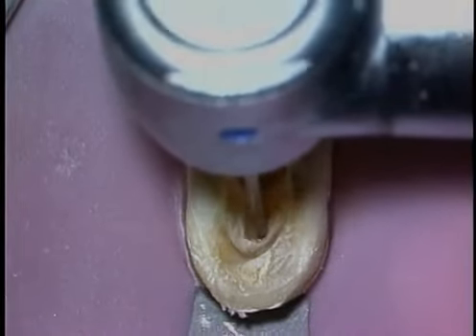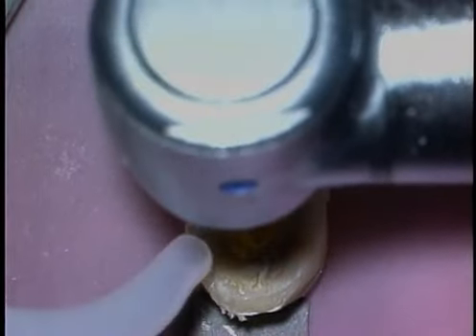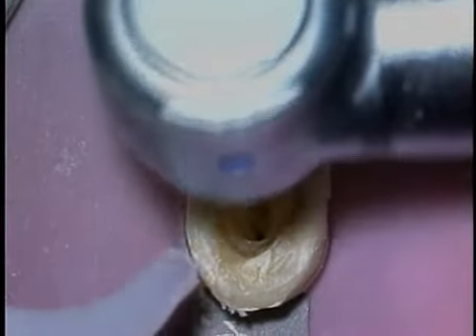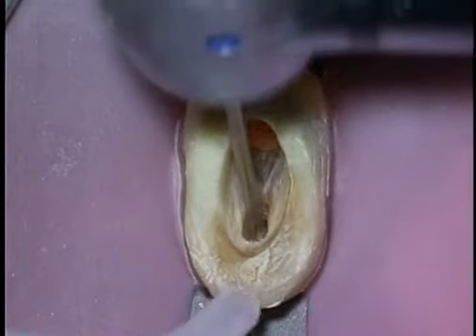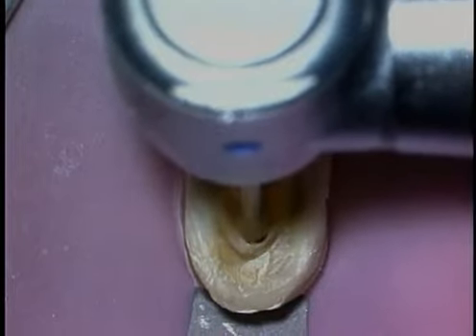Face off the orifices with small Gates Gliddens. If the orifice is restricted in diameter, it's okay to face off with perhaps a 1 or a 2 GG, and that'll create a guide path for a larger Gates Glidden. Move the head of the handpiece around from different angles to smooth up and true that orifice level up.